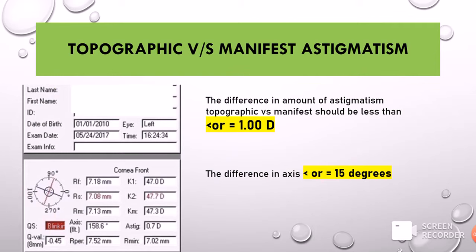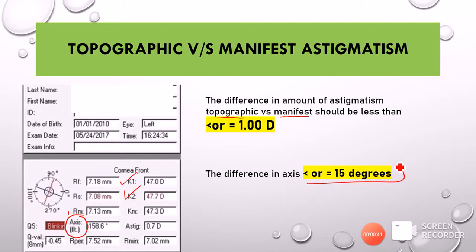Next we have topographic versus manifest astigmatism. The difference between K1 and K2 is topographic astigmatism, while the real astigmatism found using autorefractometer, subjective refraction, or retinoscopy is called manifest astigmatism. The difference between topographic and manifest astigmatism should be less than or equal to 1 diopter. Similarly, the difference between the topographic axis and the clinical refraction axis should be less than or equal to 15 degrees. Anything above that is suspicious and serves as a moderate risk of ectasia.